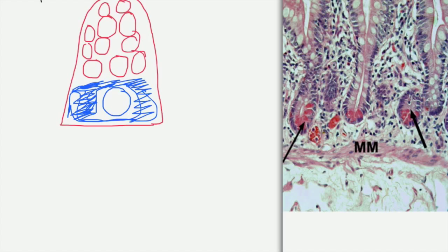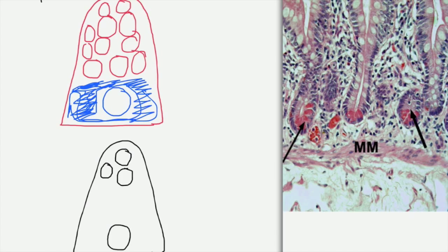As regards the EM picture, it has the same outline, and at the apex, you will have the secretory granules. Here the secretory granules are homogeneous. They have the same density.